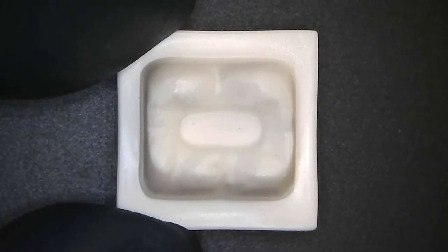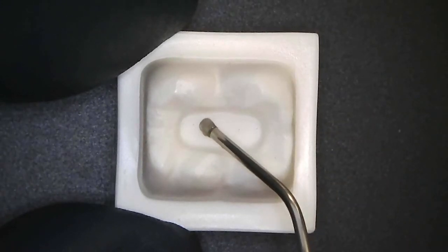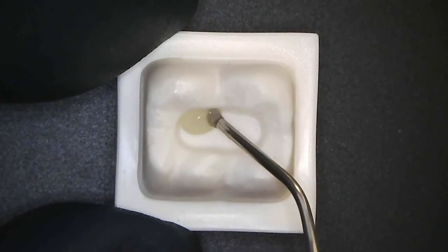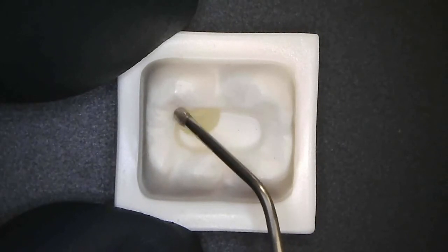Here's how I use Geneal Universal Injectable Composite to restore a class one. I build up cusps on one side of the prep, and because of its stackability, I can actually develop cuspal anatomy.